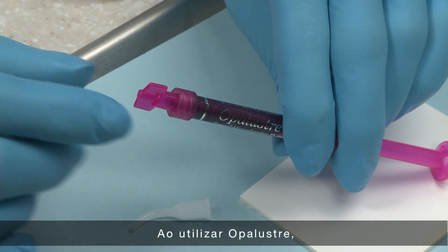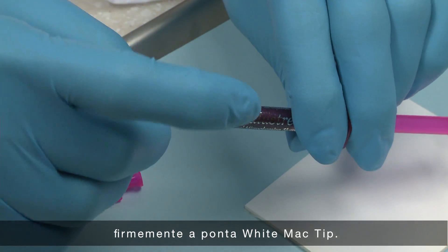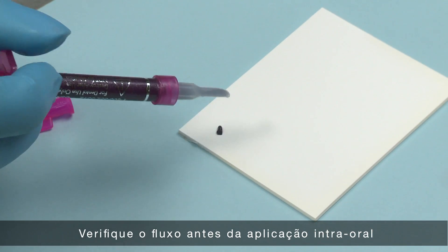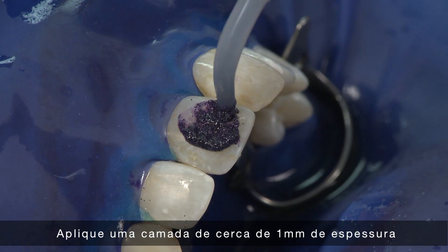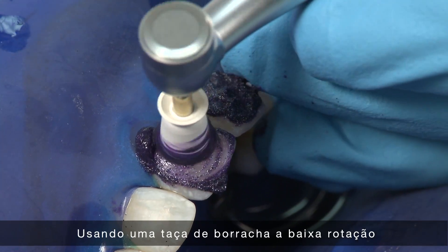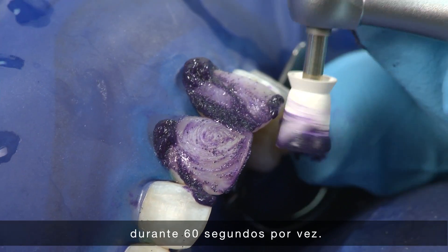When applying Opal Luster, remove the lower lock cap from the Opal Luster syringe and securely attach the white MAC tip. Verify flow prior to intraoral placement. Apply approximately a 1 mm thick layer over the discolored area. Using a rubber prophy cup at a slow RPM, apply medium to heavy pressure for 60 seconds at a time.